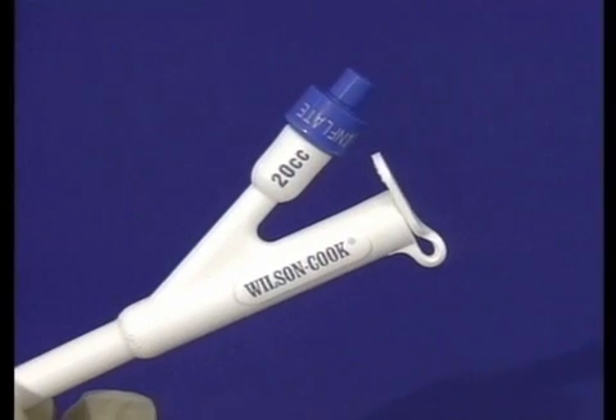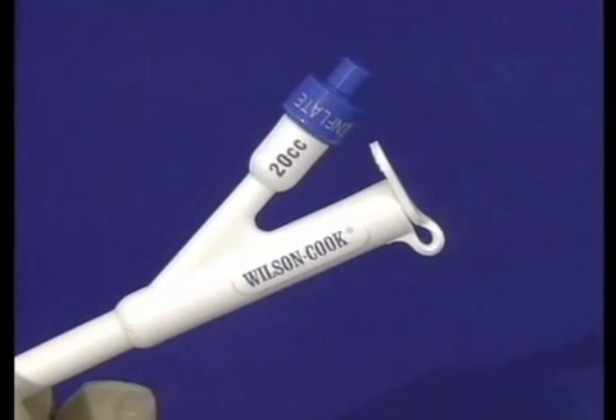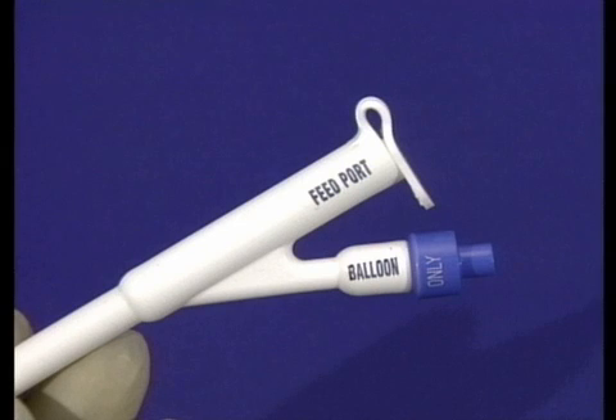The PEG24 balloon replacement tube features a color-coded Y adapter with clearly marked balloon and feed ports. The blue balloon port accepts the included luer lock syringe for inflating the balloon with 20 cc's of sterile water. The feed port accepts all delivery sets as well as a piston irrigation syringe for bolus feeding.